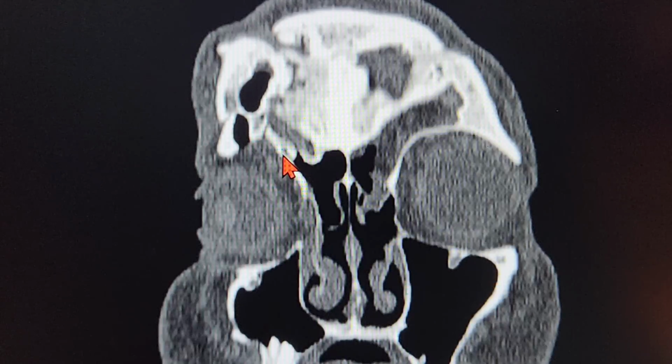Moving on behind, you can see that's still the frontal recess, and ideally this should be the posterior wall of the frontal sinus, exactly behind which will be the frontal lobe of the brain with the dura layer just behind. You can see there's some gray shadow, which is definitely brain. That is the intracranial cavity, assuming it is the same intracranial cavity which is projecting anteriorly on the posterior wall of the frontal sinus. You can see that's the lateral most part of the frontal sinus with air within.